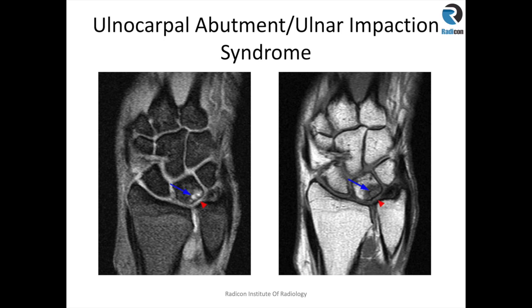You can see cystic changes within the lunate with some marrow edema. There is positive ulnar variance, appreciated on the T1-weighted sequences, and marrow signal change in the lunate. There is a mildly positive ulnar variance. This is a case of ulnar abutment syndrome with secondary osteoarthritis.